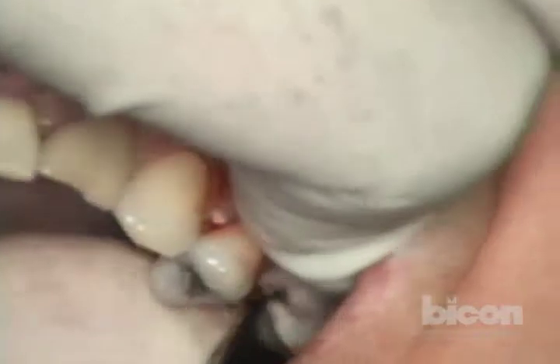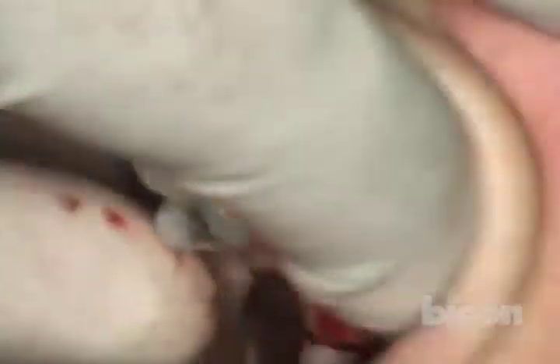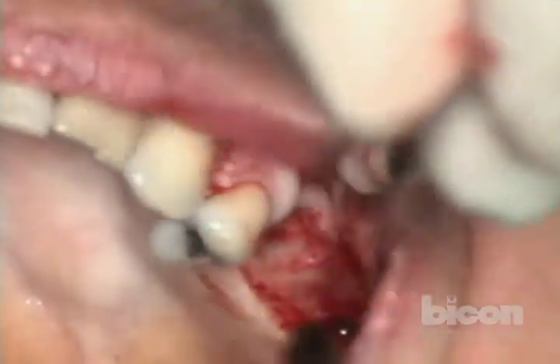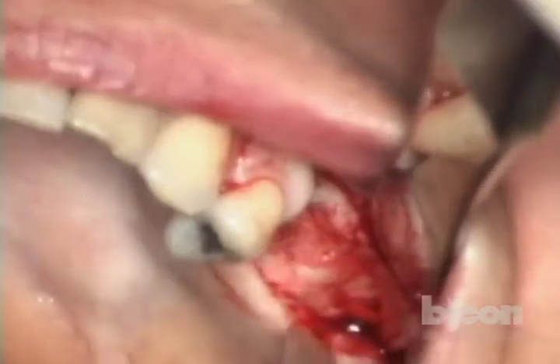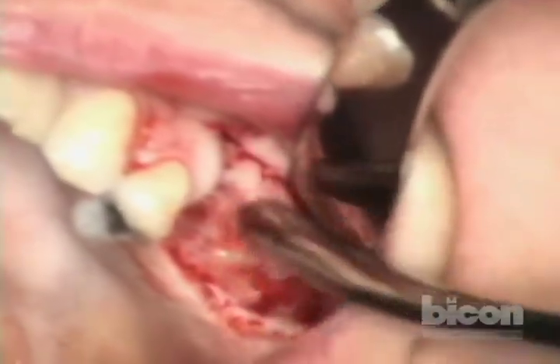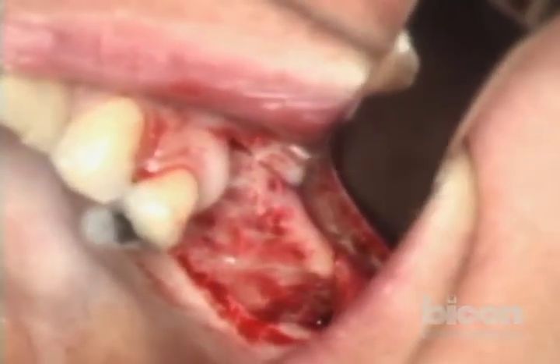This is an area where there had been an extraction not too long ago. There is a little bit of a tear here — it's not a big deal. We are using a Selden retractor. We want to make sure we free it all up and see the whole entirety of the crest.